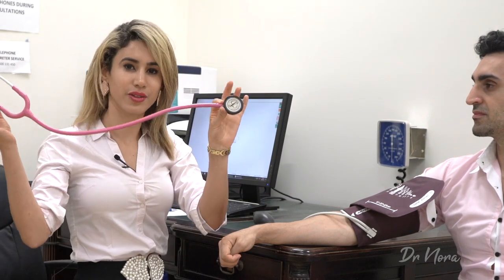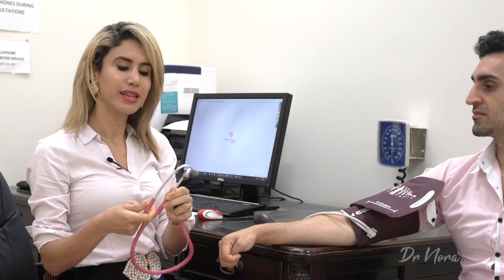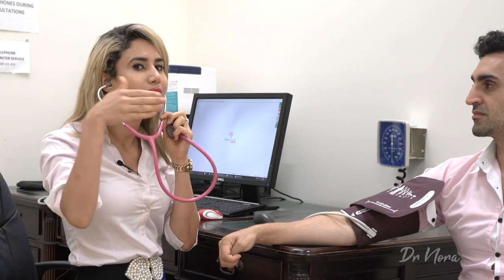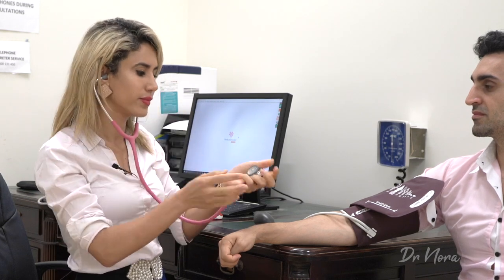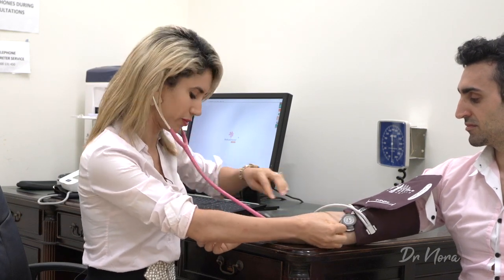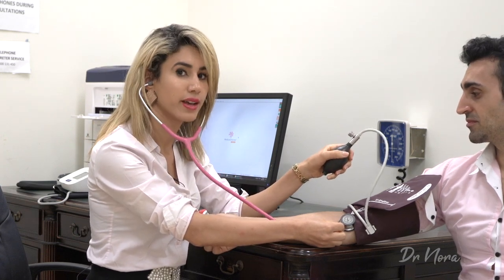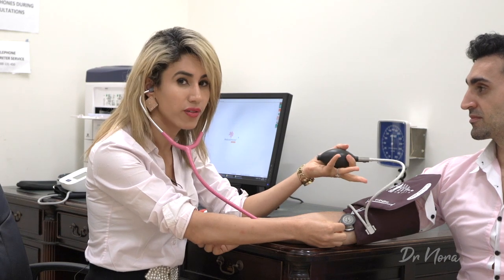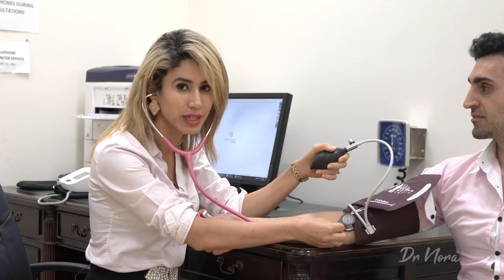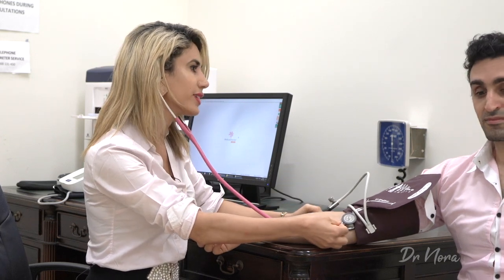Next up, get your stethoscope. For this we'll be using the diaphragm — the larger side of the stethoscope. Make sure you've turned it to the correct side if needed. Place the stethoscope earpieces into your ears and then place the diaphragm over the antecubital fossa. Now it's time to inflate the cuff. For this patient I know he sits around 120, so I'm going to inflate up to 150 millimeters of mercury.